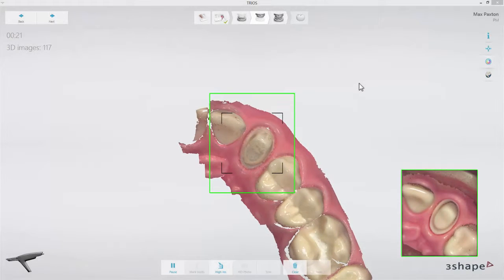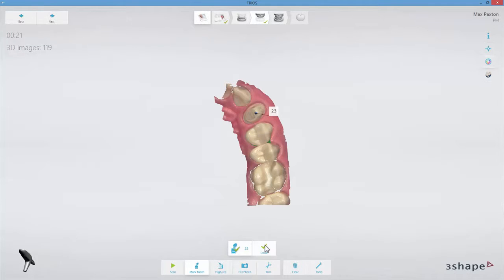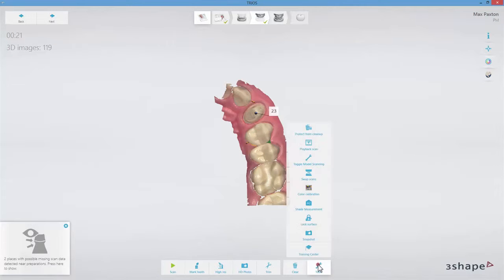The Lock feature gives an option to freeze the surface at a given state — for example, by locking it immediately after the margin line is captured. To access the feature, open the Tools menu.